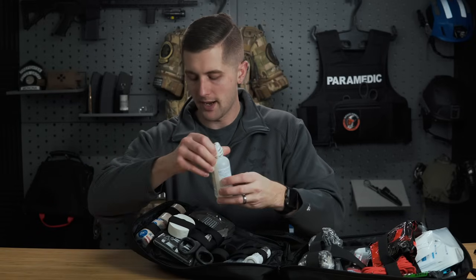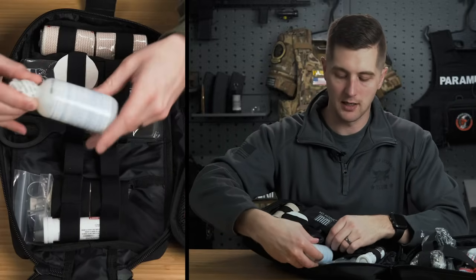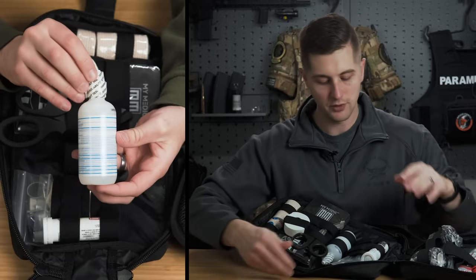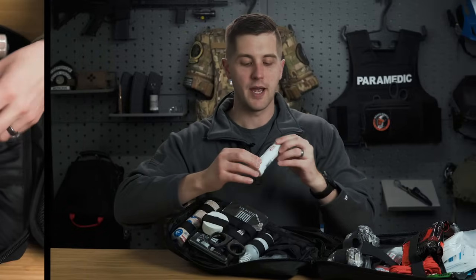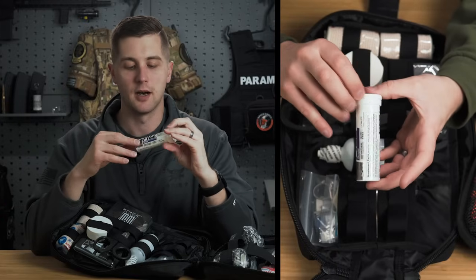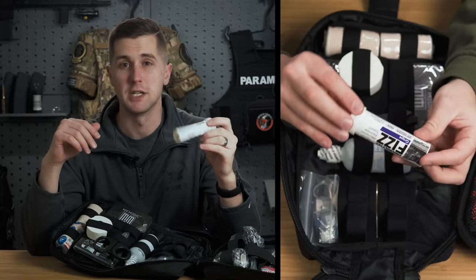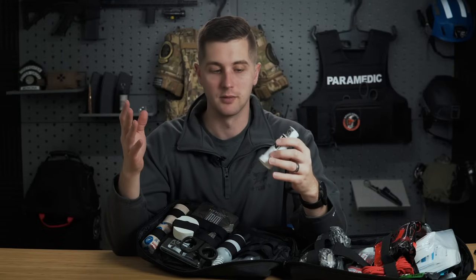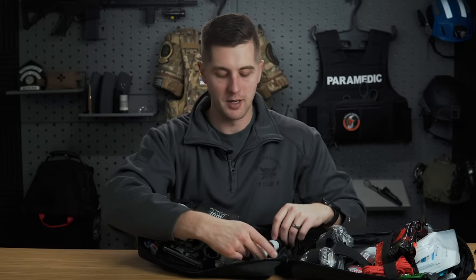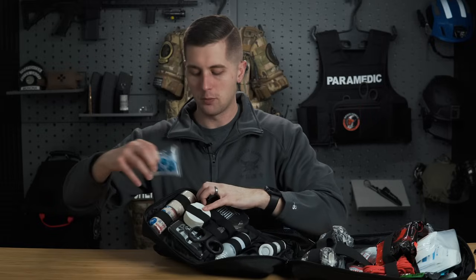Down here, we have a thing of eye rinse. So it's just a sterile water solution if you need to rinse out eyes or a wound of some kind. Down here, we have a thing of electrolytes. You know, you're hiking or you're in the middle of nowhere. You need to replenish electrolytes along with hydration for somebody to continue to function. So for any survival kit or something where you might be a ways away from help, definitely a good thing to have.